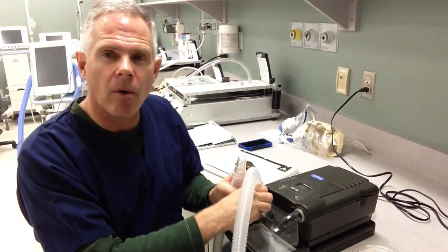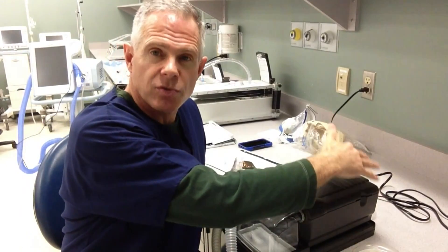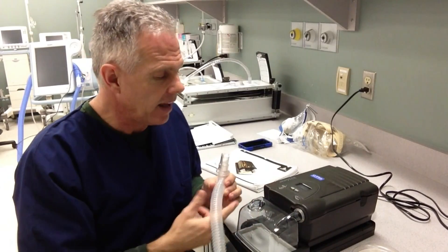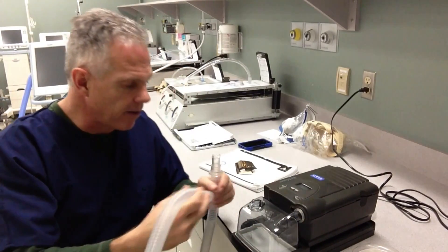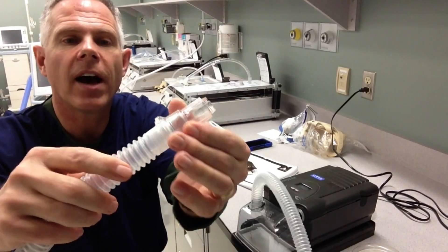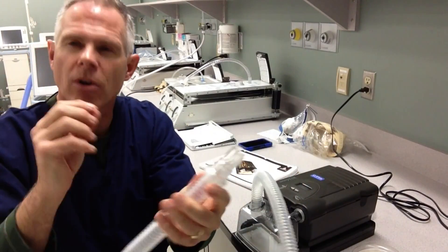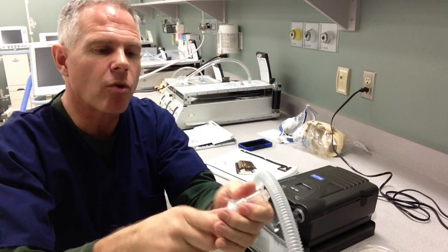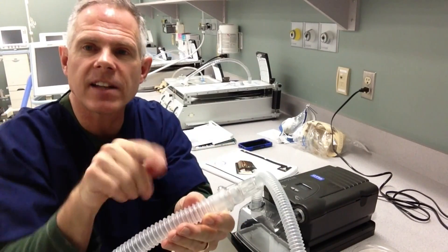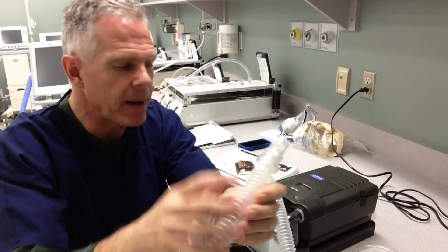The circuit is very simple. The Remstar takes just room air gas, blows it through the humidifier here, which we can turn on and fill with water so that they get humidified gas. We need one of these whisper swivels — it's a way for the extra flow to be continuously vented out through the circuit to prevent re-breathing of gases or CO2 in the patient circuit.